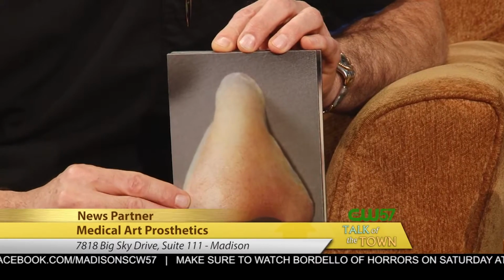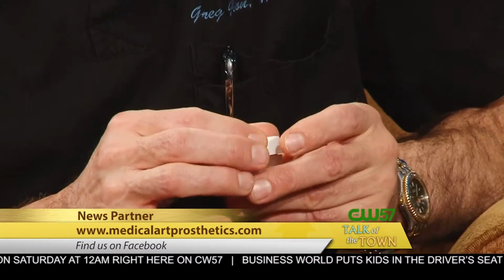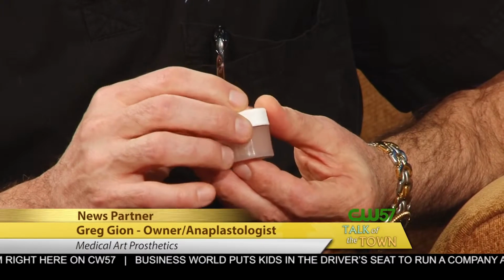In a case like this, I don't know if you can still see this or not. Sure, just in our last few seconds here, let's take a quick look. It's just an overlay prosthesis. So it's really not a full prosthesis, but it allows the person to see what their nose would look like if they wanted to wear a prosthesis each day. Oh, I see. And then very quickly, I've developed a kind of application material that can smooth and conceal some scars, things like that. And again, a daily application.